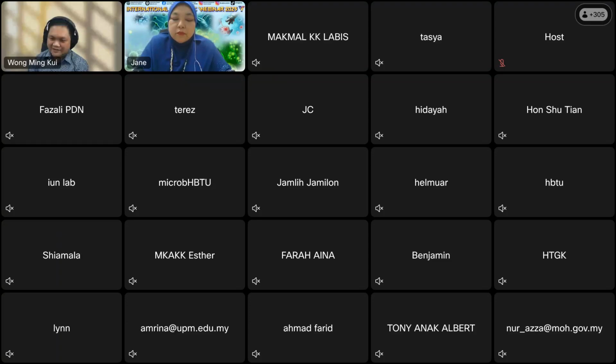Again, regarding the species differentiation, if you present to the AI, let's say this image is PF, B is PV, C is PK, something like that, definitely the model can be trained to differentiate species.